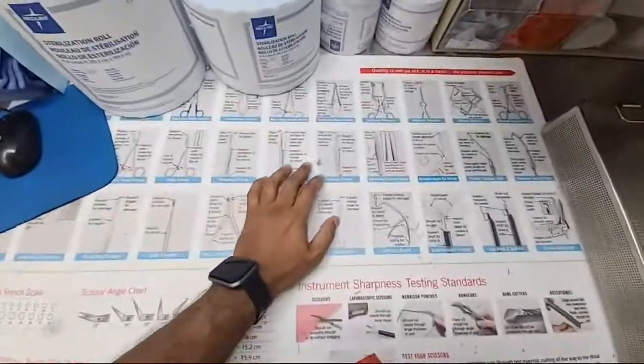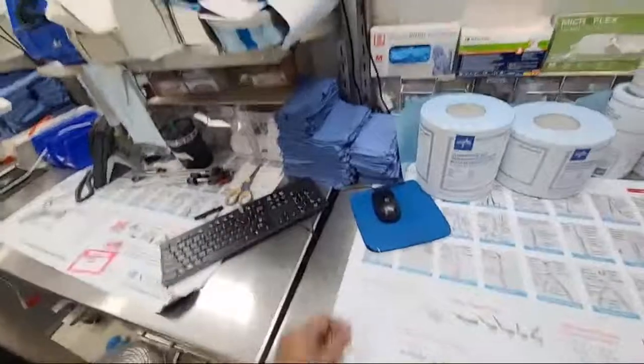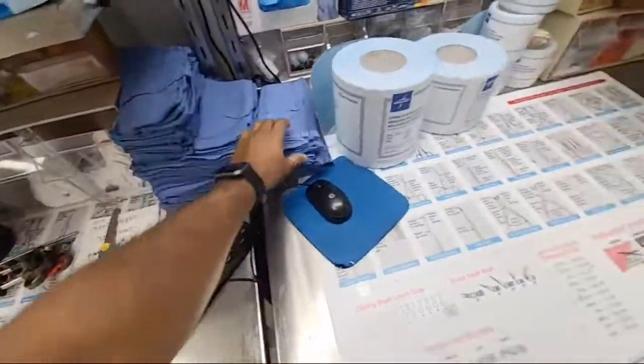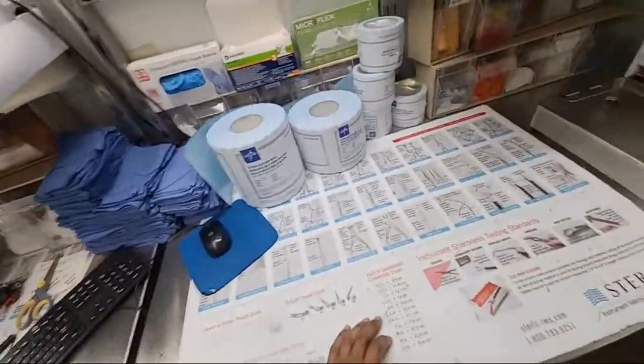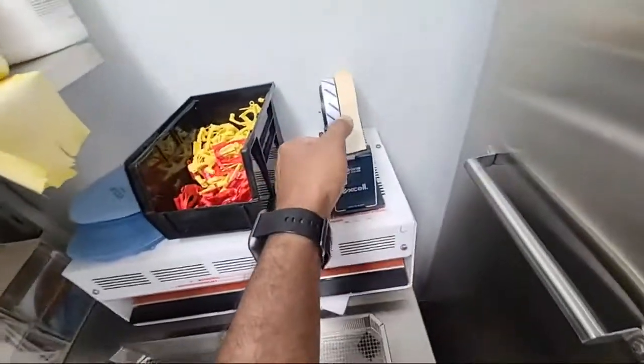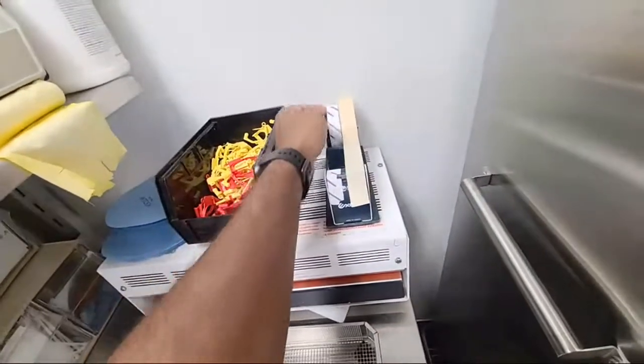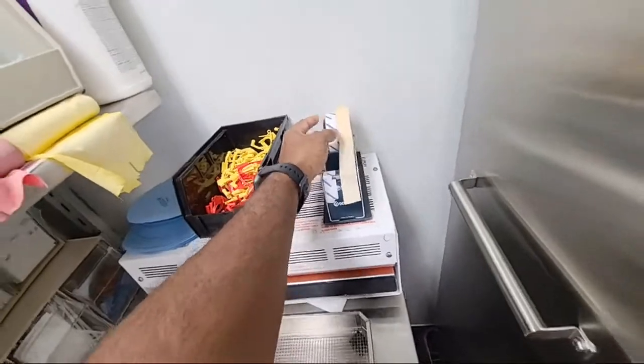Here's a bunch of information on different instruments. And then we put them together. If they don't have a liner, we add these liners. These towels are okay to use. And what else? Oh, here's the CI tape that we use for the steam. This is the CI tape we use for the hydrogen peroxide. All right.